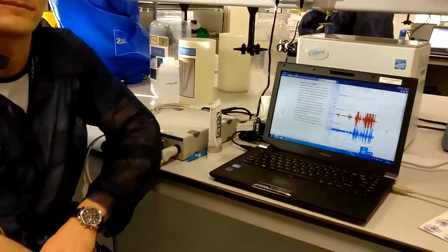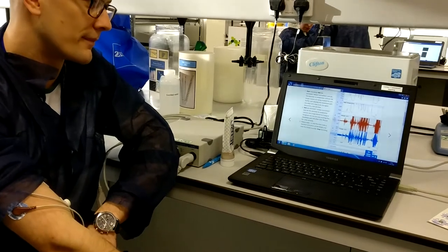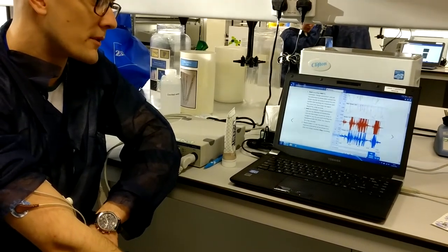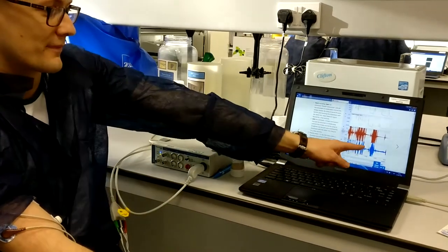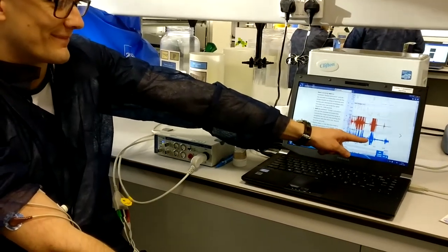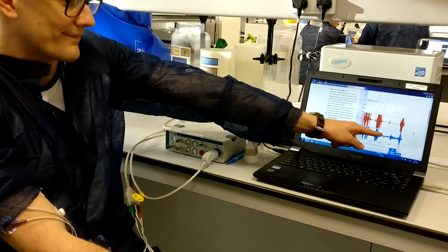So if I try and get you both in frame... So like if I do this, the bicep goes and the tricep drops up. Could you point with your left arm to the screen? With my left arm? Yeah, so if you do something with your right... There we go. See that jumping?